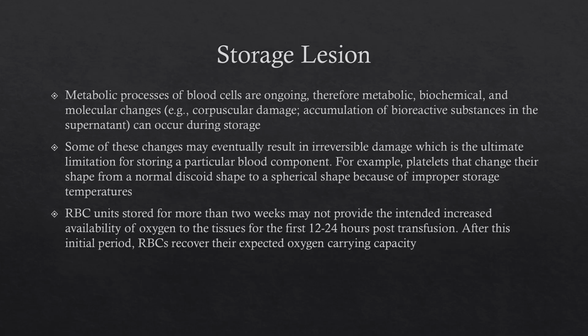Storing blood components is not without its drawbacks. Remember that all blood components, those cells are living cells. They're undergoing cellular respiration. They're using up their available food sources.